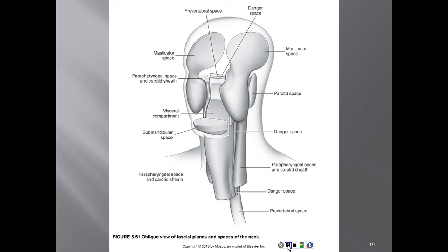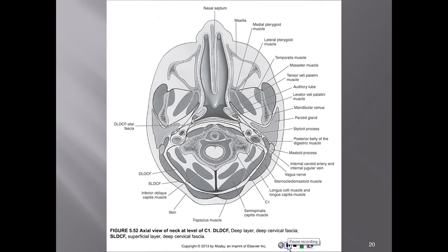Knowledge of the anatomy in these compartments improves the ability to predict the spread of pathology throughout the soft tissue structures of the neck.